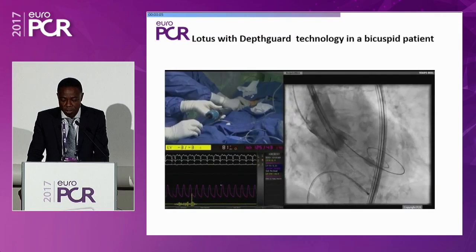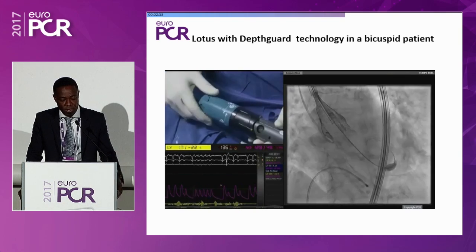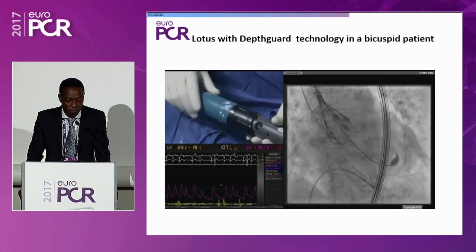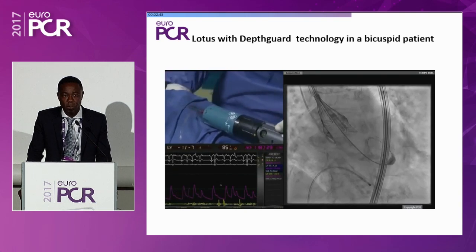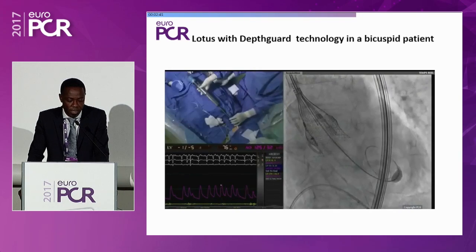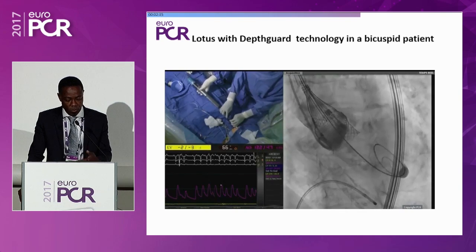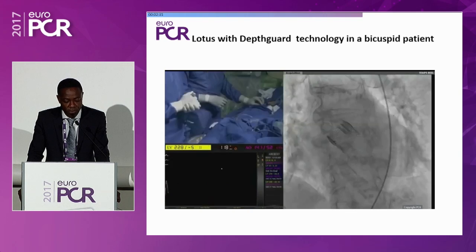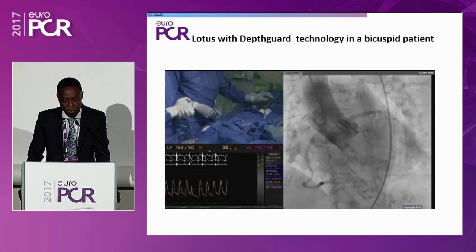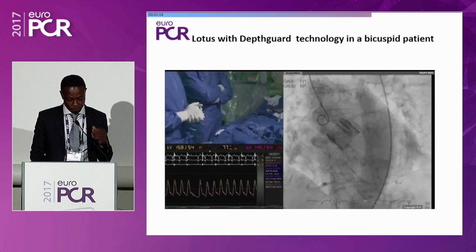Nevertheless, this was a depth guard case. With the control provided by the depth guard, keeping once again the posts at the level of the annulus to achieve a high implant. This is the patient for whom you've seen the pre and post CT scans. It's really control. You see no rush once again during the deployment. You can nicely appreciate the location, the position various times during the deployment. And at the end, what we aim at is to obtain a high implant and no regurgitation. So you can check at various steps of the procedure, even in a bicuspid patient, and this should really be the goal with the LOTUS for any type of case, any patient: high implant, patency of the coronary arteries once again, and no regurgitation, or the minimal regurgitation achievable.